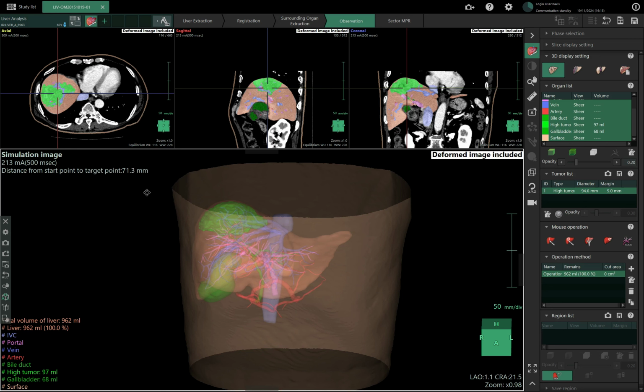And I couldn't argue against that, because we have the FDA marking, we have the CE marking, but nothing else. The thing is that behind Cela, I don't know about Ethicon, but I am afraid it's the same, there's a radiologist verifying all the extractions and that all the segmentations are exactly correct. We are not. We are just trusting and feeding the extraction algorithm of the software with deep learning and a lot of additional studies.